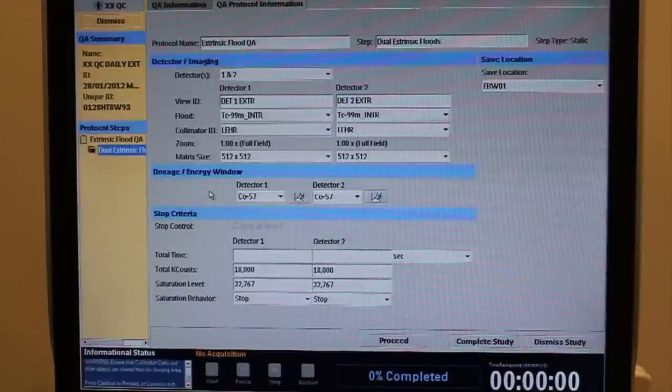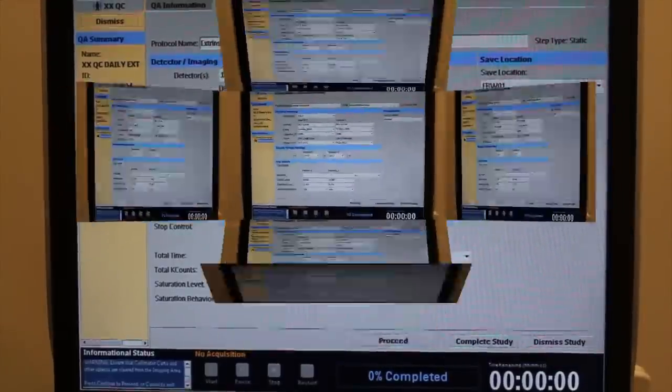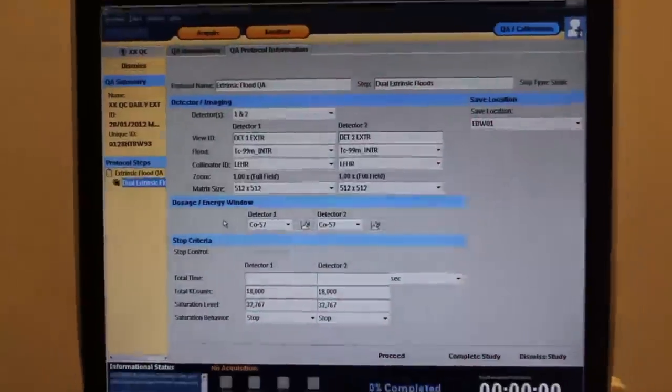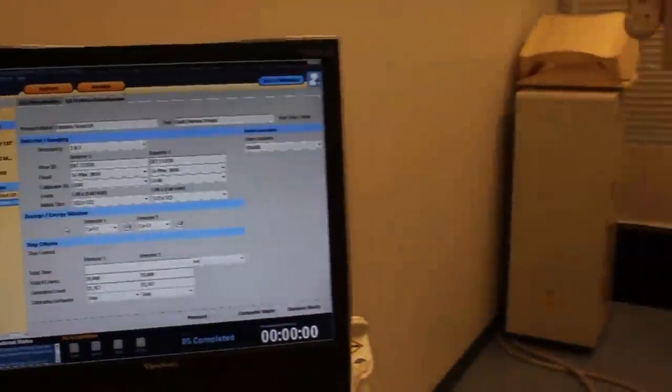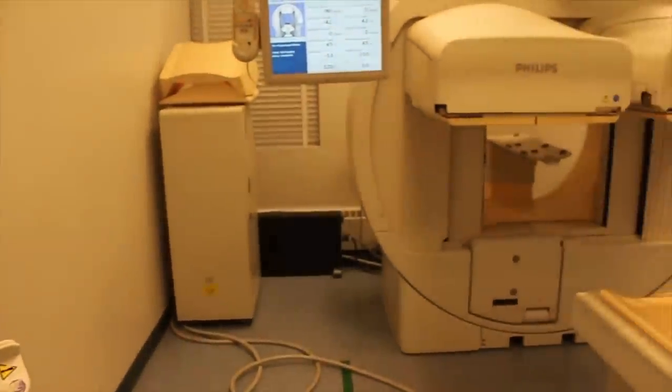Select Cobalt 57 if you are using a sealed cobalt sheet source. Select Technetium if you are using a Technetium filled phantom sheet source.